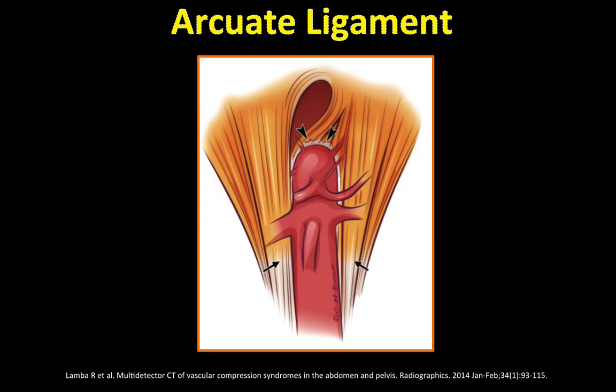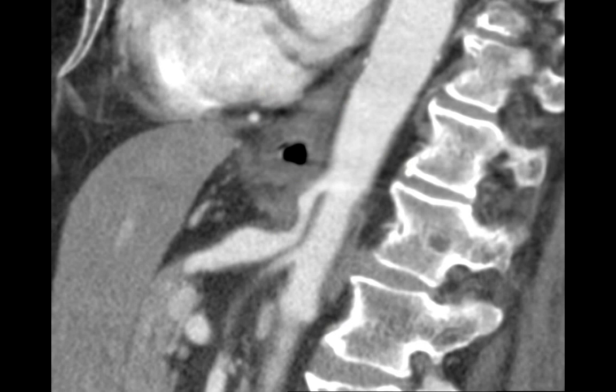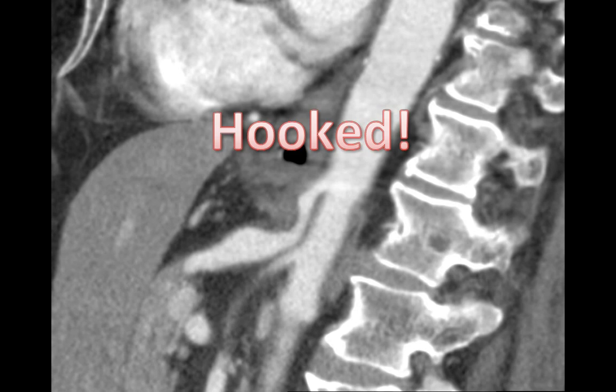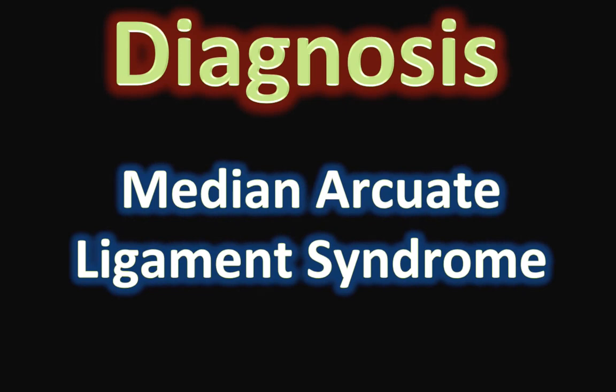But in a proportion of patients, this crosses over the celiac artery. It is important to remember that only a proportion of these patients may have symptoms, so this appearance should always be correlated with the clinical picture before calling the syndrome. The classic appearance on the sagittal image has been described as a hooked appearance of the celiac artery. So the diagnosis is median arcuate ligament syndrome if the patient is symptomatic.